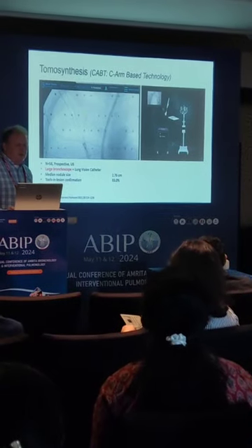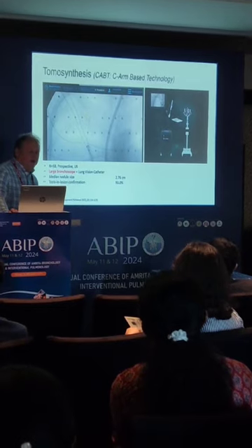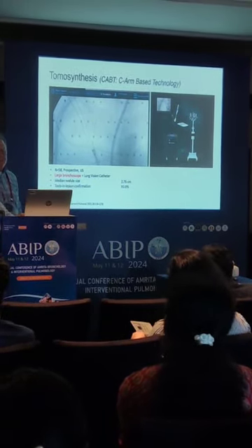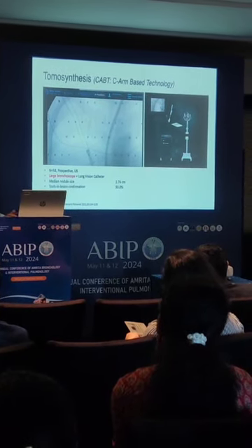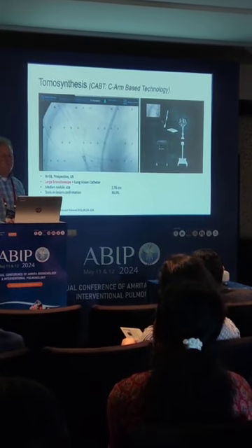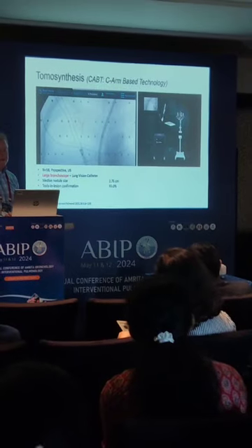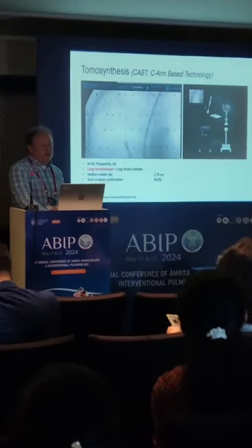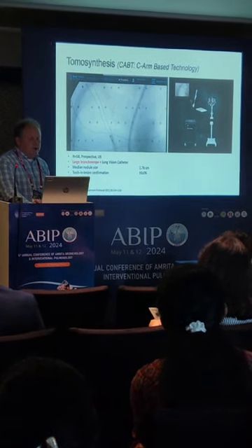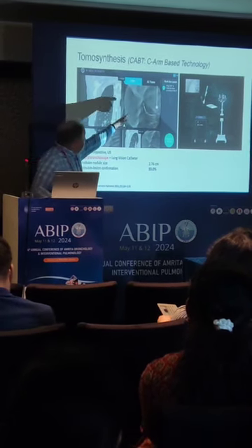Now, this was a small paper that came out from the Cleveland Clinic, 58 prospective cases. The advantage here was that the Cleveland Clinic has multiple different technologies, so they decided just to use the scope and a catheter. Here's just putting the radial EBUS probe out. Now they were using larger nodules, 2.7 centimeter nodules. But look at the tool-in-lesion confirmation at 93%. They were able to confirm they were always in the lesion. And here's what the video can look like. See? That's it in real time.